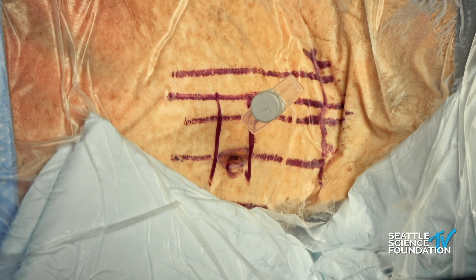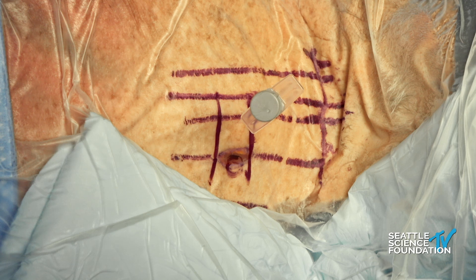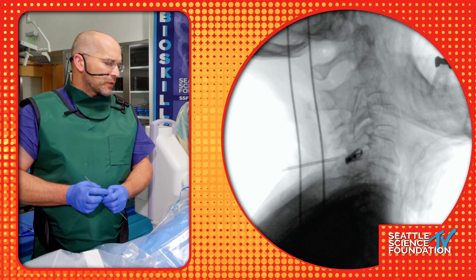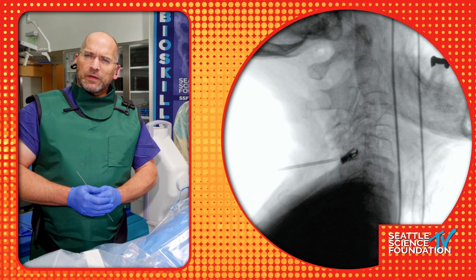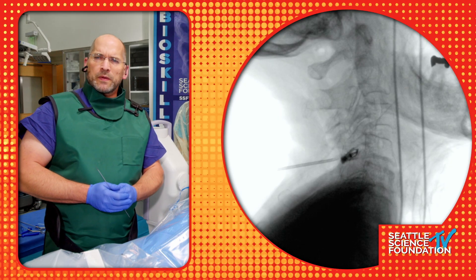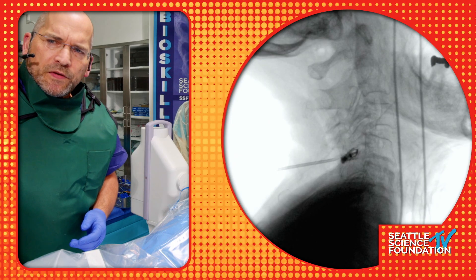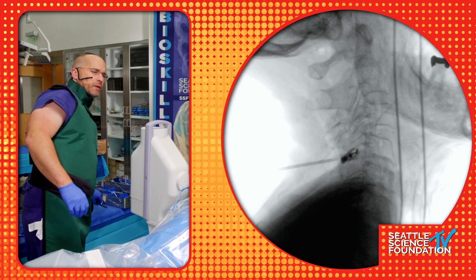We'll move over to a lateral x-ray. I do a foraminotomy on the same level. You can see that we have the approach angle — it's a little bit less steep than the facet. You can basically make an angle between the disc and the facet line and cut it roughly in half.